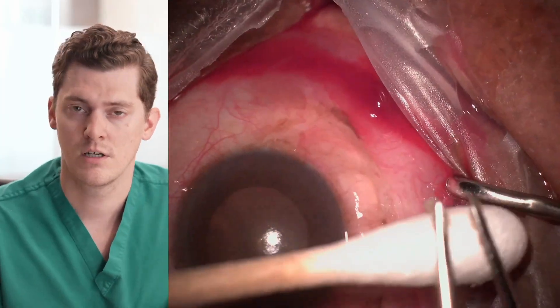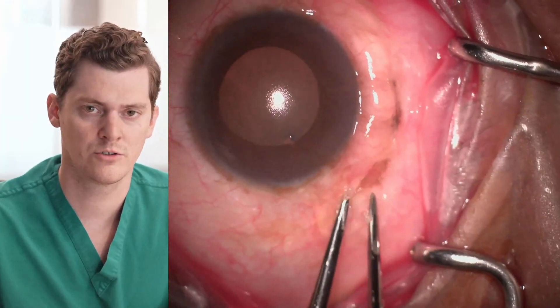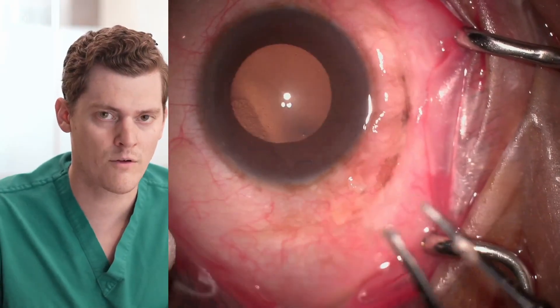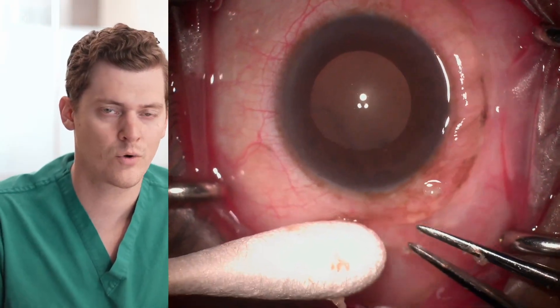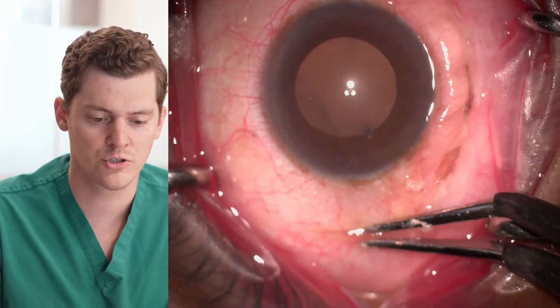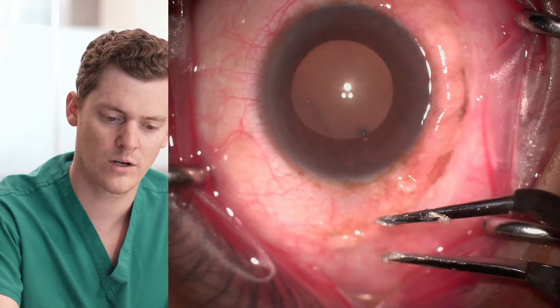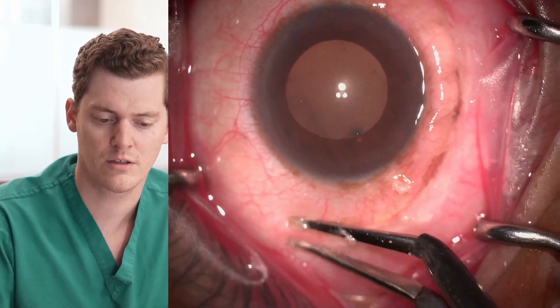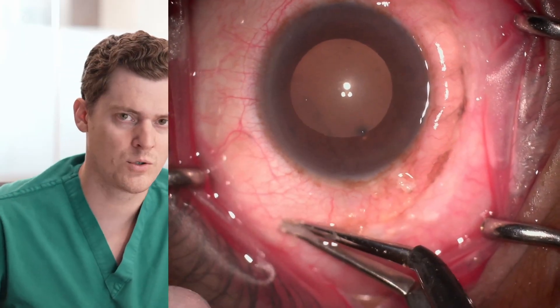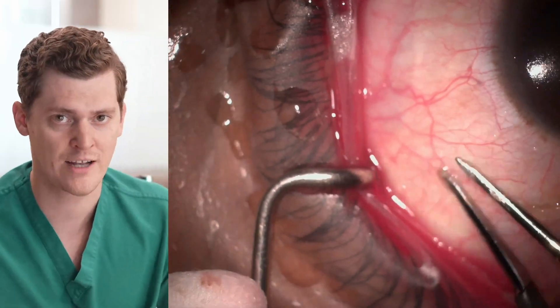Another issue with surgical excision is that it's very localized — you can really only do the inferior bulbar conjunctiva, or only the superior, or only the areas most affected. However, with cautery you don't have those limitations. You can do all quadrants of the bulbar conjunctiva, shrinking areas as you work your way around the globe. By being able to address all quadrants, we're really able to address the patient's symptoms in a better fashion.